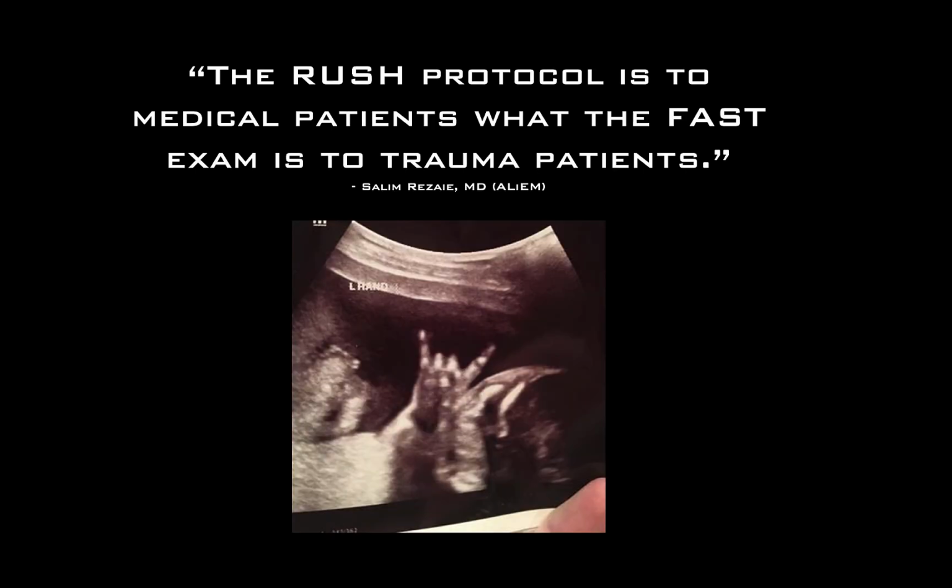A memorable quote from Salim Rezaie, who's the founder of Academic Life in Emergency Medicine. The RUSH protocol is to medical patients what the FAST exam is to trauma patients.